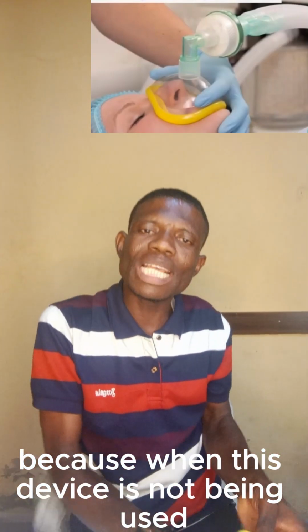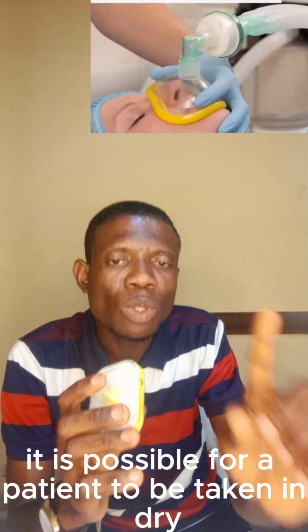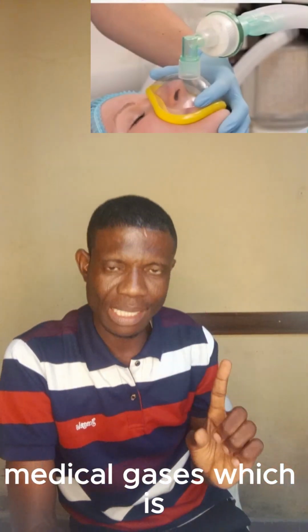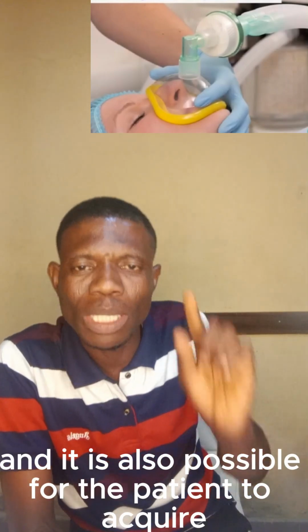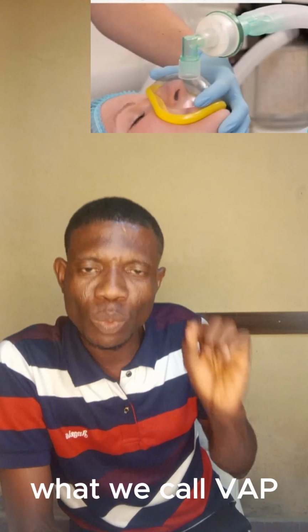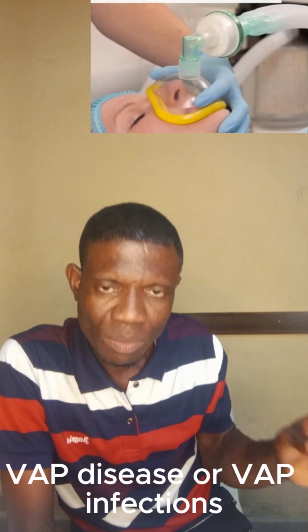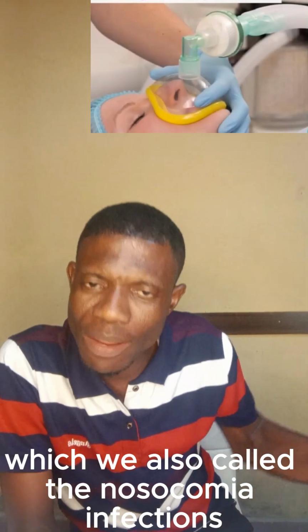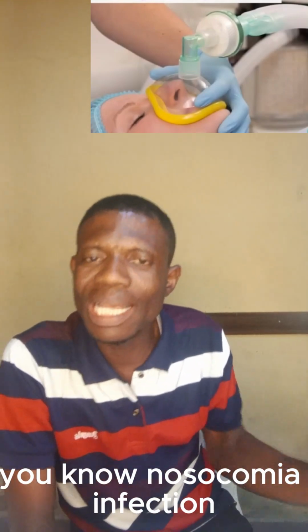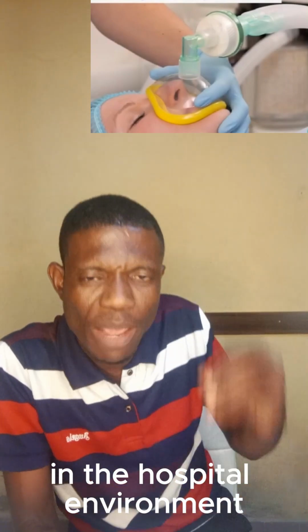Because when this device is not being used, it is possible for a patient to be taking in dry medical gases, which is very dangerous. And it is also possible for the patient to acquire what we call VAP infections, the ventilator associated pneumonia, which we also call nosocomial infections. You know, a nosocomial infection is a type of infection that is acquired in the hospital environment.